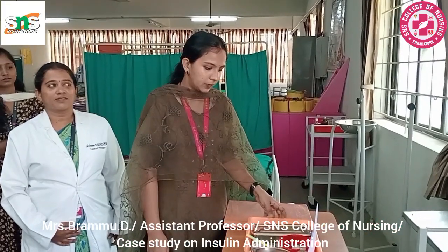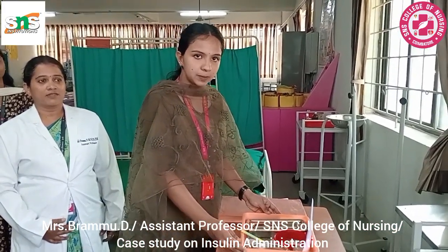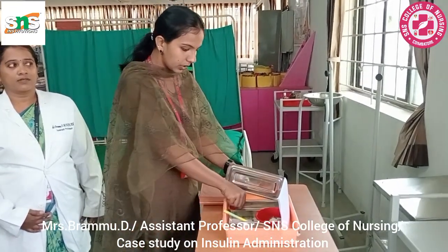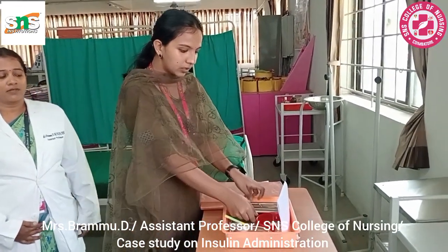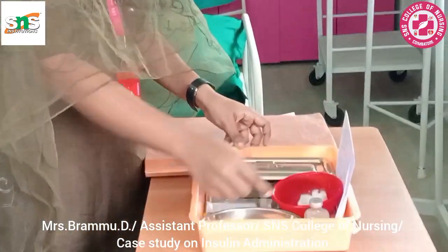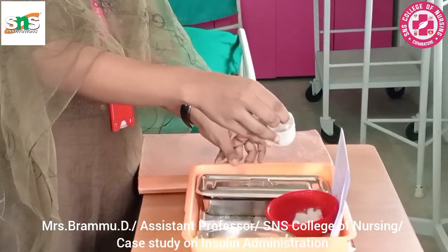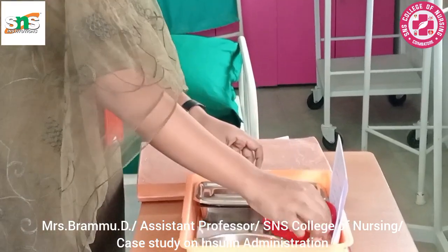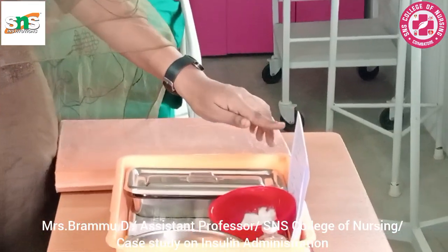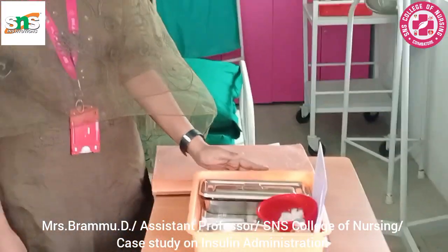First, we need to set a tray for insulin administration. A clean tray containing an injection tray with loaded insulin, then a bowl containing cotton, injection human Actrapid vial and a kidney tray. Then for documentation, a medication card and pen are also present.